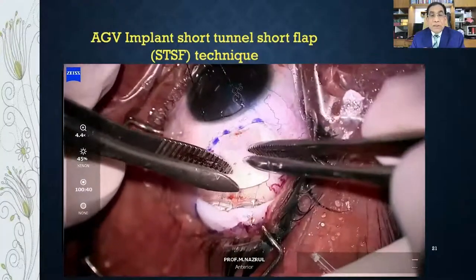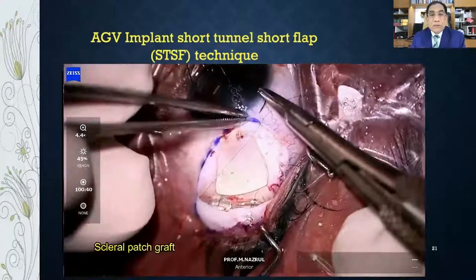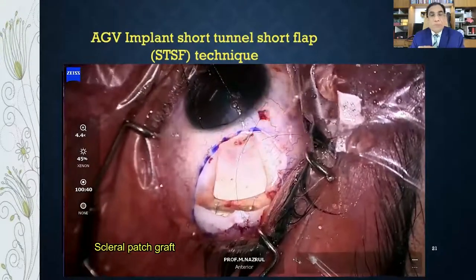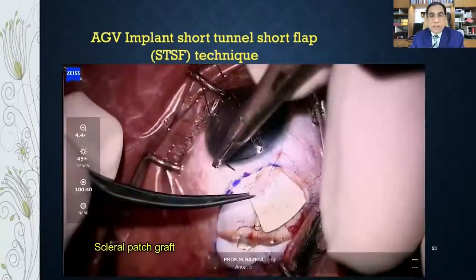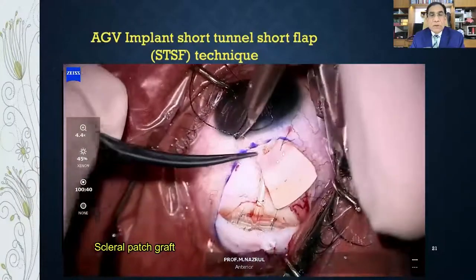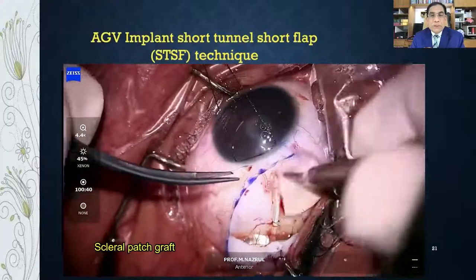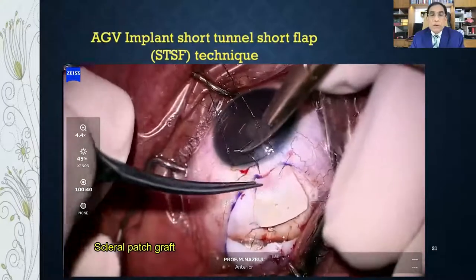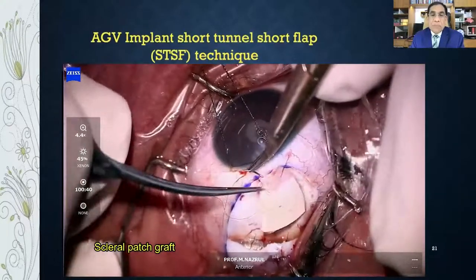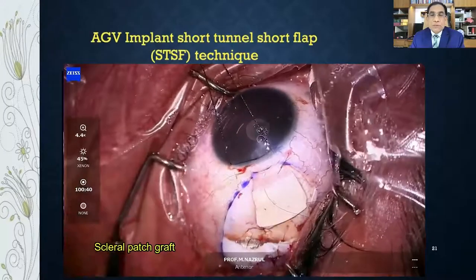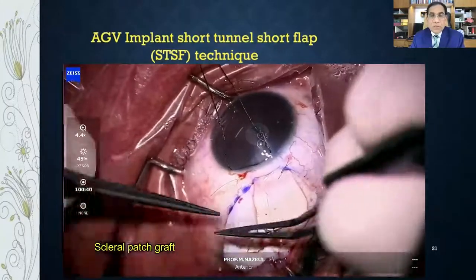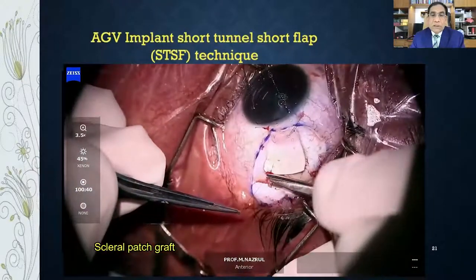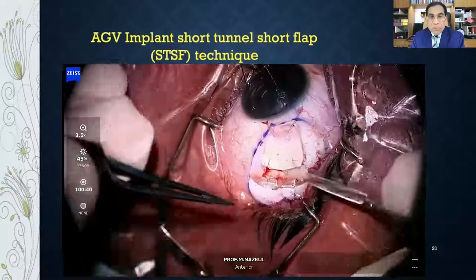In this particular case I am using the patient's own scleral graft. Most of my patients have the STSF technique, but in children, highly myopic patients, or staphyloma cases, you must use donor scleral, corneal, or pericardial graft. Suture it with at least two to four sutures to fix it over the tube. Then cover with Tenon's capsule and conjunctiva.